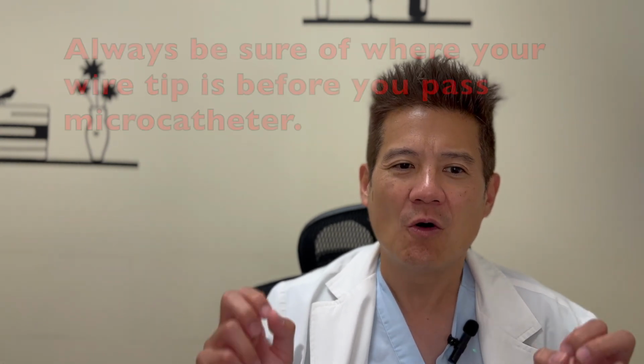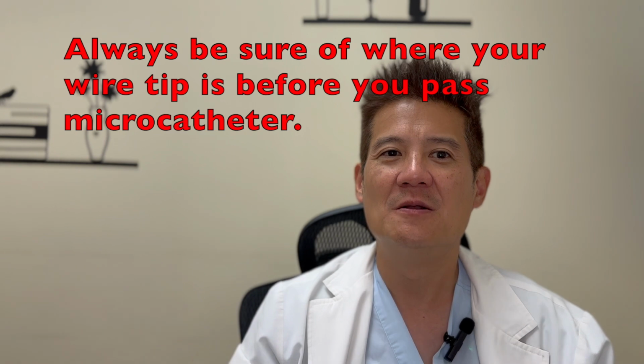The second thing is wire perforation. When you're doing CTO, often the wire will go outside the vessel architecture. When that happens, usually nothing bad happens. You pull it back and redirect the wire, everything's fine. The problem comes when you try to pass a balloon or microcatheter to follow that wire. So one principle is always be sure where the wire tip is before you pass the microcatheter. Avoid passing the microcatheter until you're sure your distal wire is in vessel architecture. If you're not sure of the vessel course, we always recommend knuckle wiring to remove vessel ambiguity.